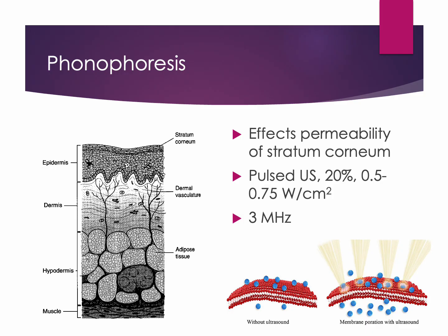The outermost layer of the skin, the stratum corneum, normally acts as a barrier that limits penetration of many topical medications. The mechanical effects of ultrasound may temporarily disrupt the lipid structure within the stratum corneum and increase movement of substances across cell membranes. Acoustic streaming and stable cavitation are thought to create microscopic alterations in the skin barrier, allowing topical medications to penetrate more effectively into underlying tissues. This increased permeability may enhance delivery of certain anti-inflammatory or analgesic medications applied to the skin during treatment.